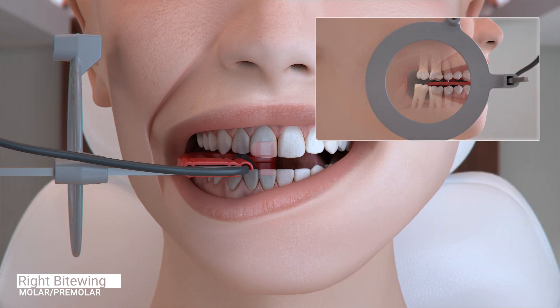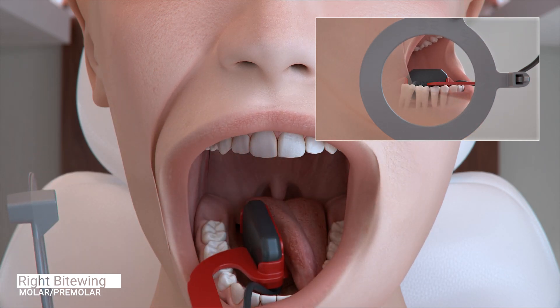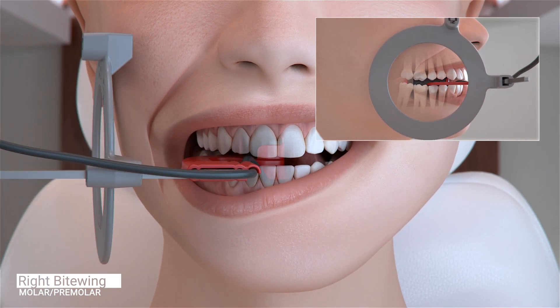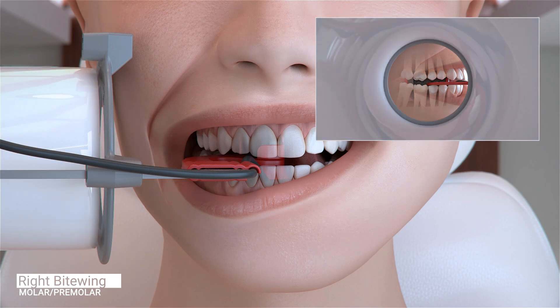Ask the patient to open slightly, slide the sensor forward and center the first and second premolar on the sensor. Move the sensor toward the midline and slightly forward again to capture the distal of the canine and ask the patient to close. Slide the aiming ring close to the patient's face, position the x-ray emitter cone flush with the aiming ring and trigger the exposure.